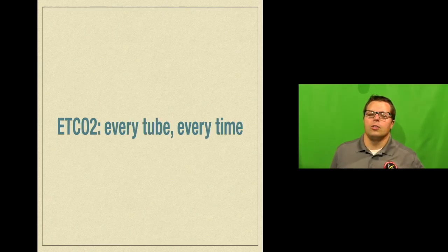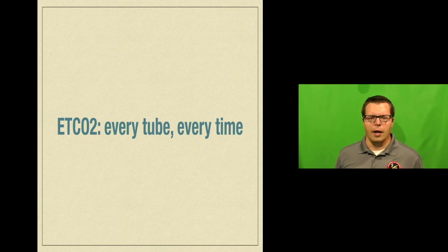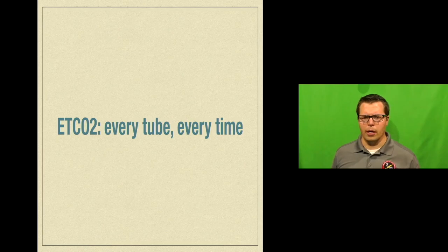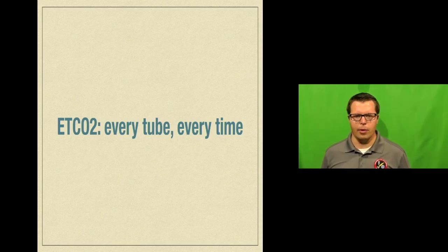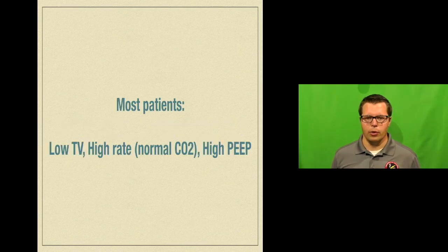We're going to put end-tidal CO2 on every tube and everything we stick in somebody's mouth and everything we put over somebody's face. We're going to do that every time. And the tube is not in the right spot until you see a relatively normal appearing end-tidal CO2 waveform. If you don't have the ability to see an end-tidal CO2 waveform, you probably shouldn't be doing any kind of airway management in my mind. There's no reason not to at this point.